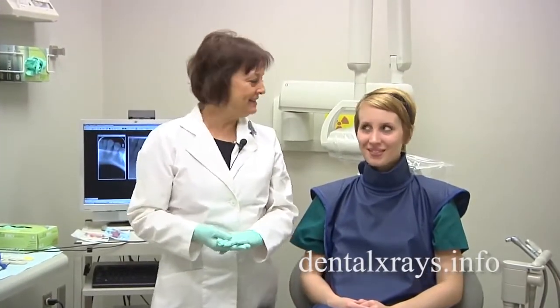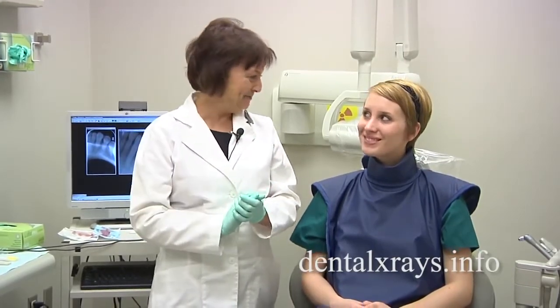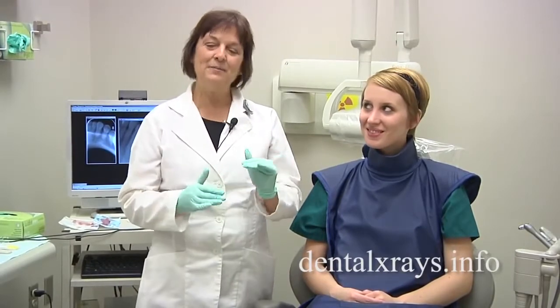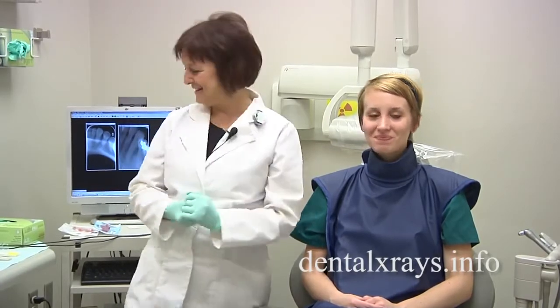I'm going to show you a few techniques that you can use when you're doing the anterior PAs of a narrow mouth. If you have the perfect ideal patient, you usually don't run into any problems. It's when you have these difficult patients, whether they're narrow or shallow palate or whatever, that's where you have to do a little bit more creative x-raying, as I say.